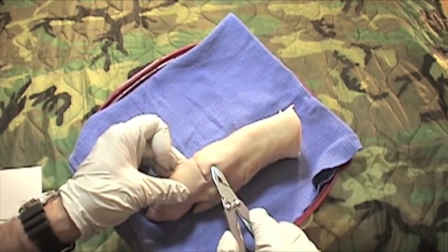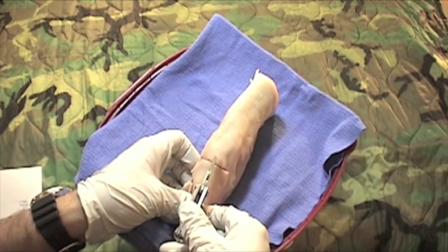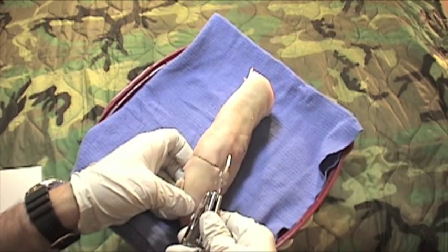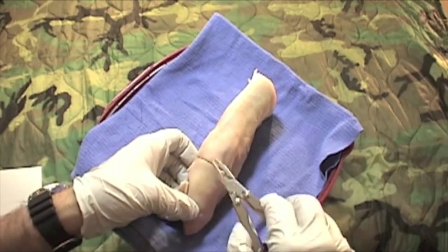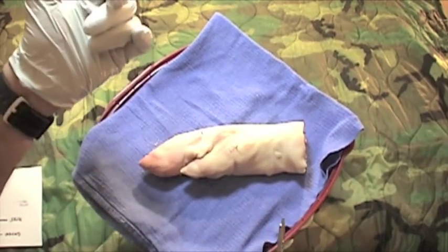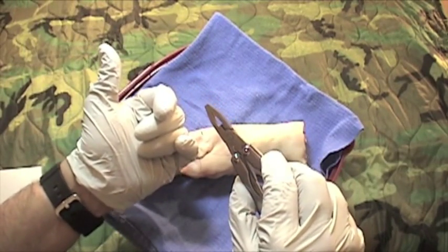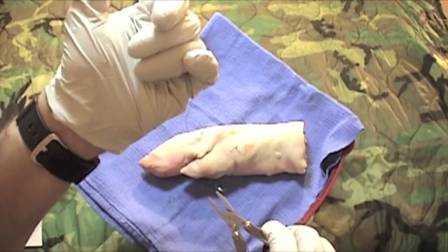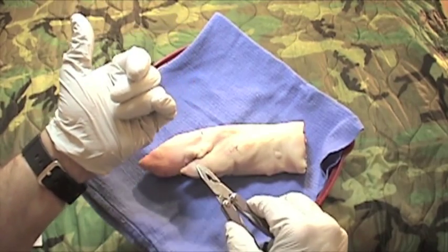Let's look at a longer wound. This is going to be divided in half — put the first stitch in the middle, and then roughly seven sutures to close something that length. Depending on how well you can manipulate the Squirt, you may get that many sutures out of a pack or you might not.